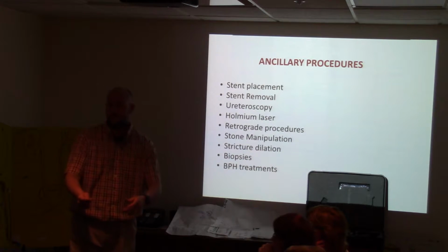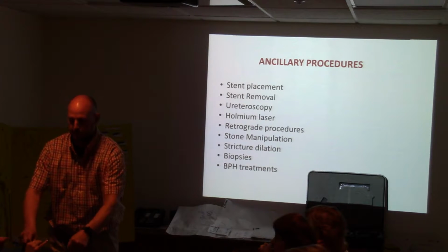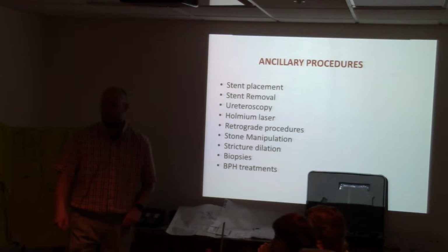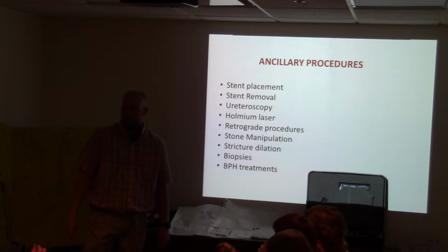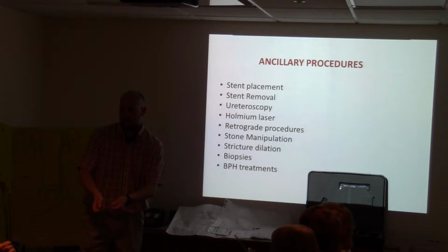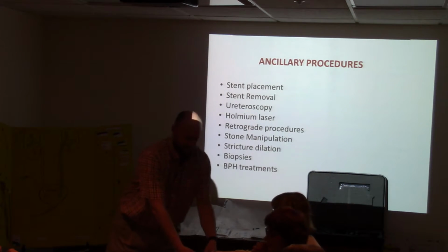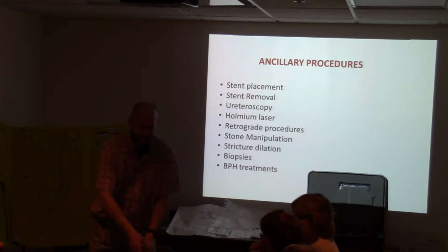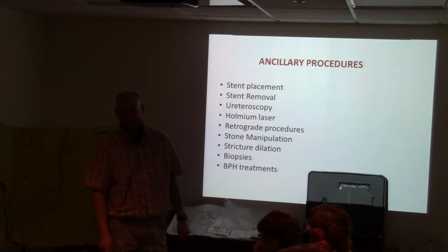Or you can pass this around. Feel how tacky the wire is, and then dip it in the water and feel how slippery it is. So imagine trying to hold on to that. It's kind of crazy. It's so hard to, and then the doctor yells at you when you're slipping all over.